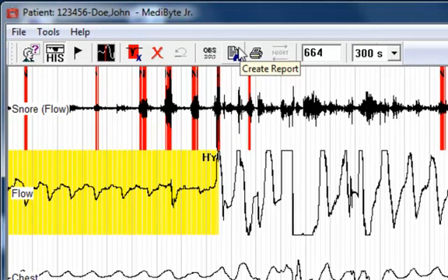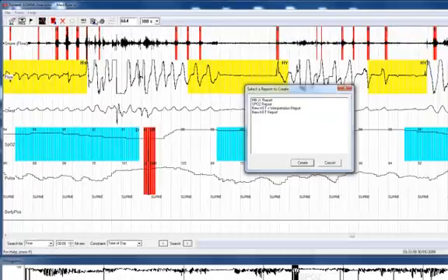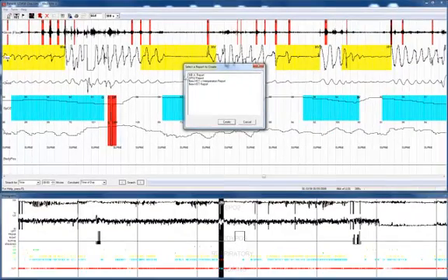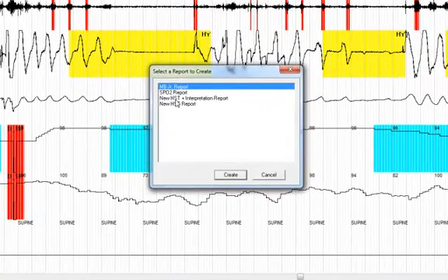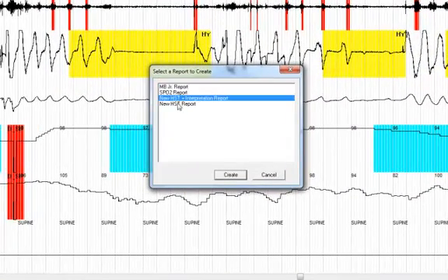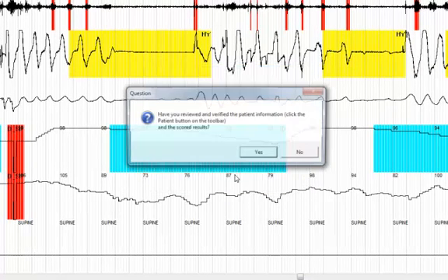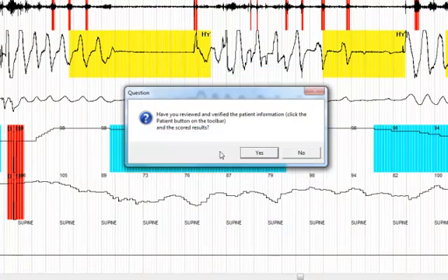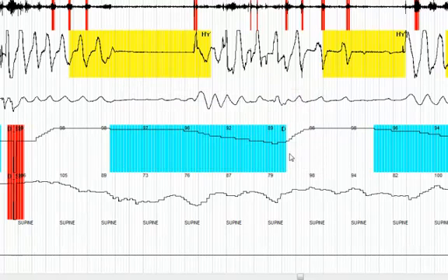The create report toolbar icon is used when you are satisfied with the data and you wish to generate a report. Click on this toolbar icon. Select the report. Click create. At this point you need to confirm that you have reviewed and verified the patient information and the scored results. If you click no, you will not be permitted to generate the report.